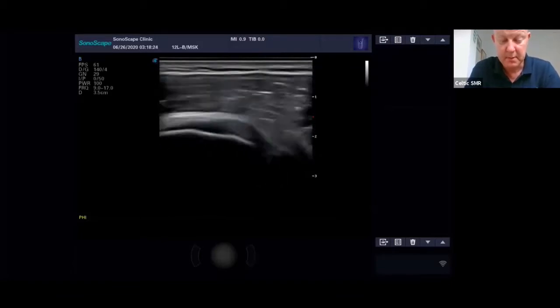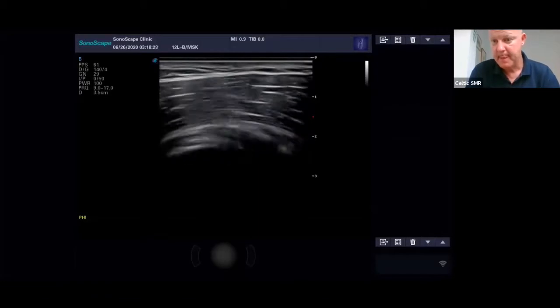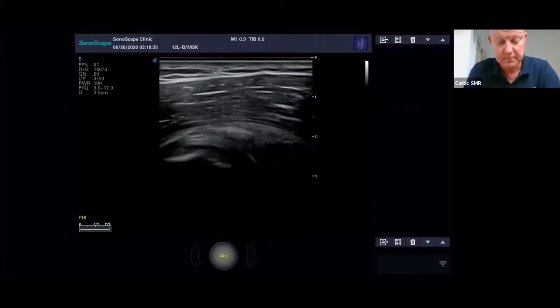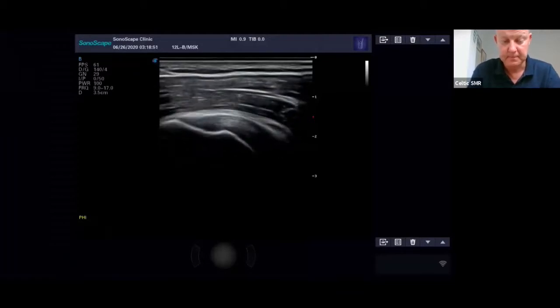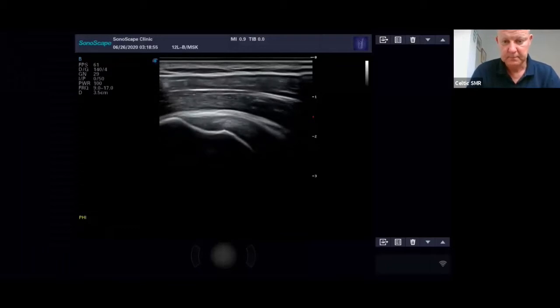So what you can do, if you lose yourself, if you go fully medially, you'll see this tendon here. I'll freeze that. This is actually the biceps tendon at its most medial aspect. If you lose yourself, you can go as medially as you can with the probe, and then as you come back out laterally, the first thing you'll hit is the supraspinatus. That's a good way of finding your supraspinatus.